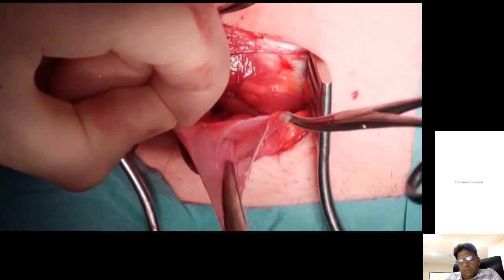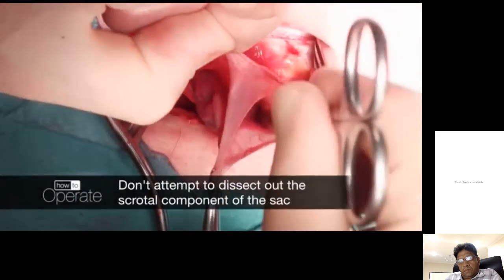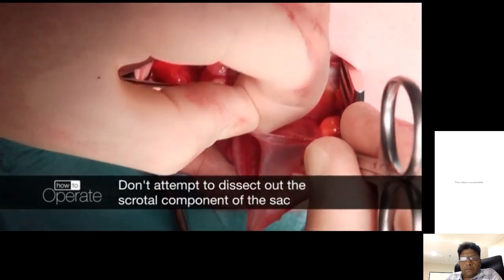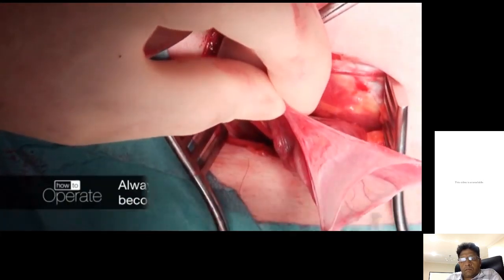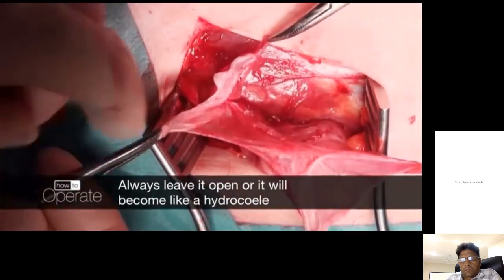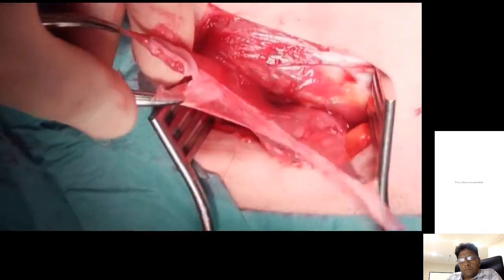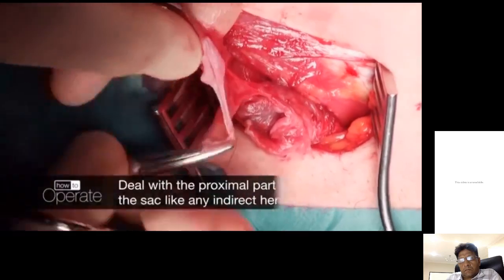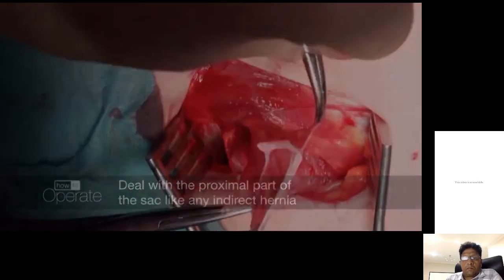There is the distal part of the sac. It goes all the way down into the scrotum. I'm not going to dissect that out because it's just going to cause a lot of bleeding. We can leave that open. I'll just open it up a little bit more, so if there's any fluid in there, it can drain into the surrounding tissues. And we'll leave that be. We don't need that anymore. No longer wanted. And we'll turn our attention to the proximal part of the sac.